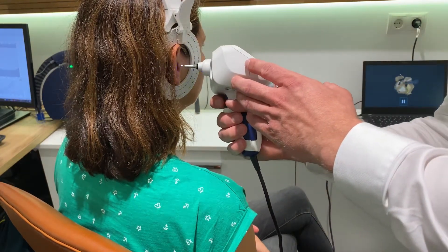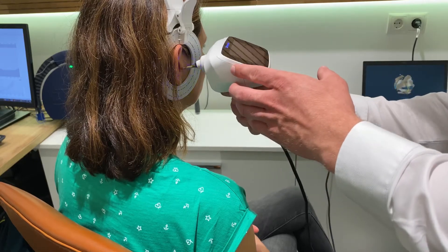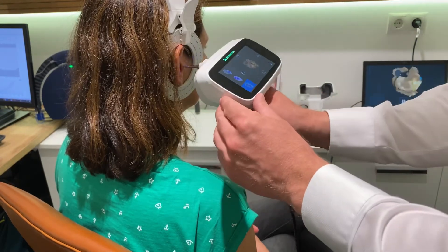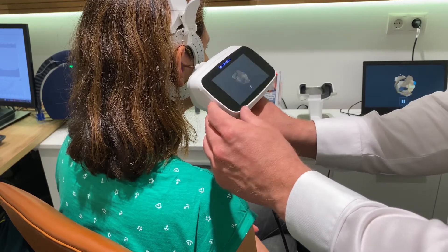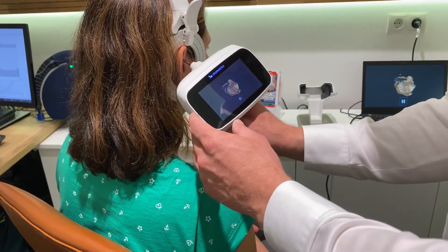There is a lot of data to be scanned. This is not the ring scanner — there is another one on the Otoscan. I will switch back to the ring scanner and scan there. Maybe I missed some areas of the pinna, and now I'm going to fill them out.